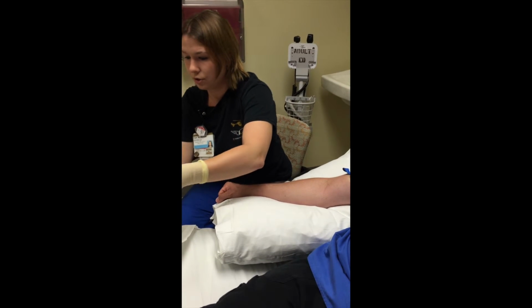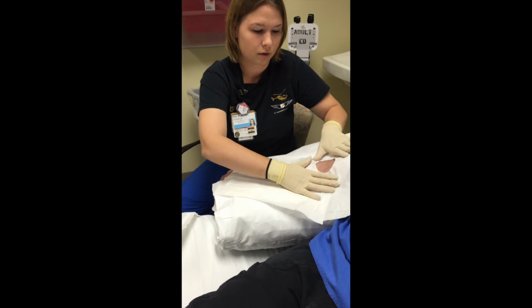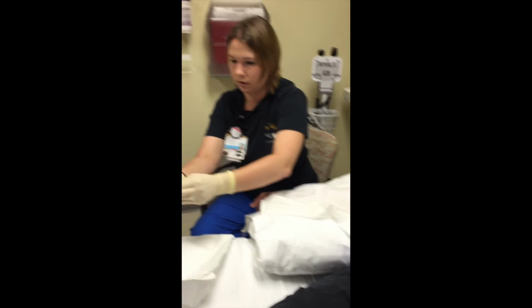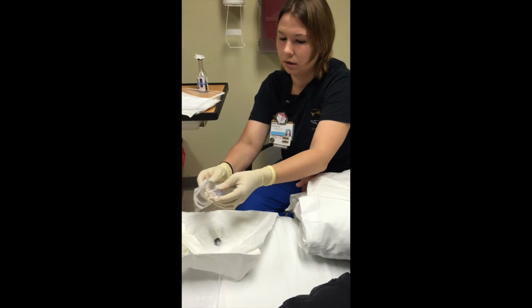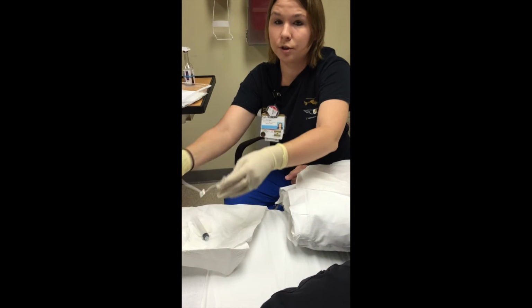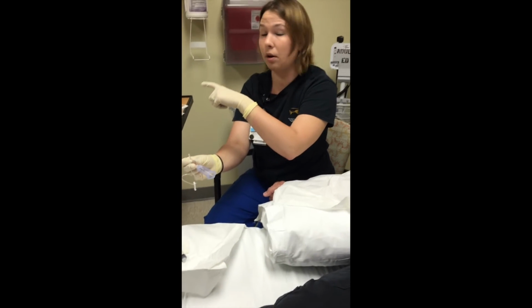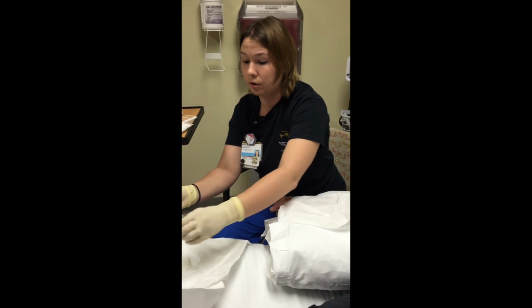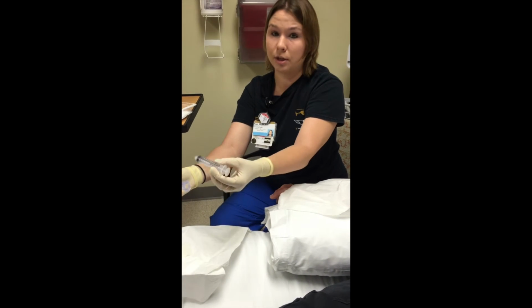You're going to take your drape. When your drape is sterile, you're going to put this over the area you want to target. You're going to open your sterile vacutainer. You can actually do this one of two ways. Some people want to use the vacutainer to stick onto the bottles. You can do that. Or you can actually remove the vacutainer right there and put the syringe on instead.